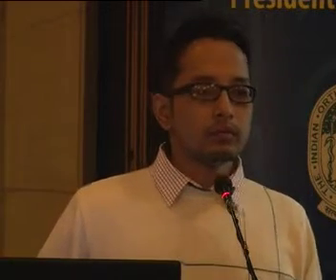So what I suggest is to carefully evaluate the pre-op x-rays for signs of retroversion, or else go for CT scans. I look specifically for the crossover sign, for both the anterior and posterior margins of the acetabulum. If there is a crossover sign, it indicates that the native acetabulum is in retroversion. Then you have to voluntarily keep your cup in an anteverted position. So in such a case, conforming the cup to the native margins of the acetabulum is not going to work.